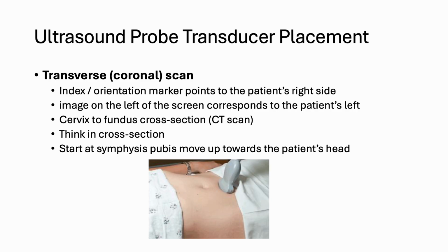When you learn sonography, they do teach you to have a very structured way of doing things rather than just scanning all over the patient. That way you keep your reference and the locations of the female anatomy correct when you're assessing the mother and the fetus. I do recommend that, especially in the beginning. A lot of times you'll see more experienced sonographers or more experienced midwives not follow a very strict pattern. But as you're learning, I would recommend that you start at the symphysis pubis and move up towards the patient's head.